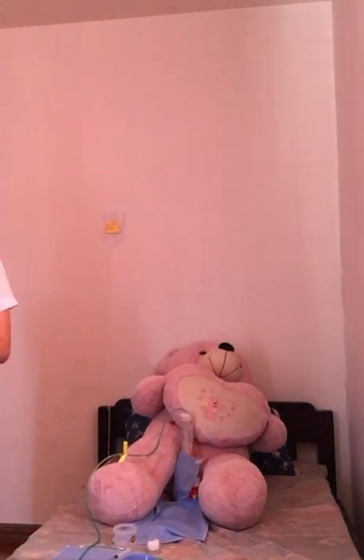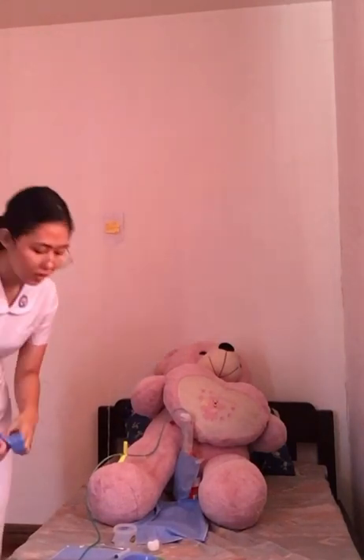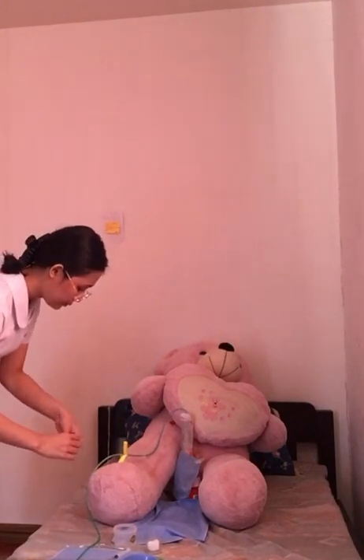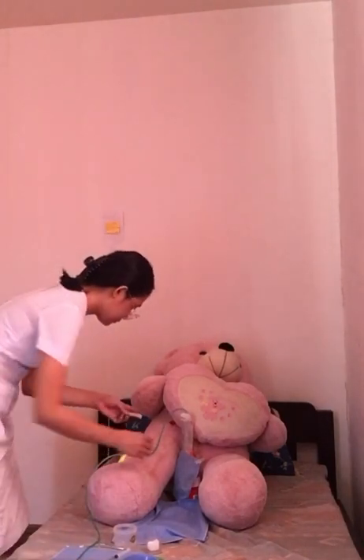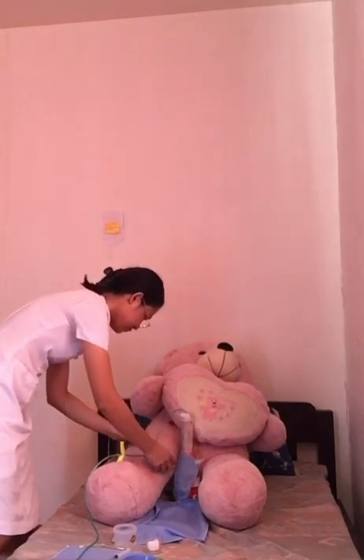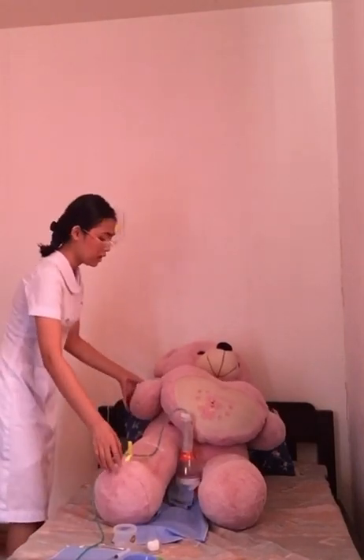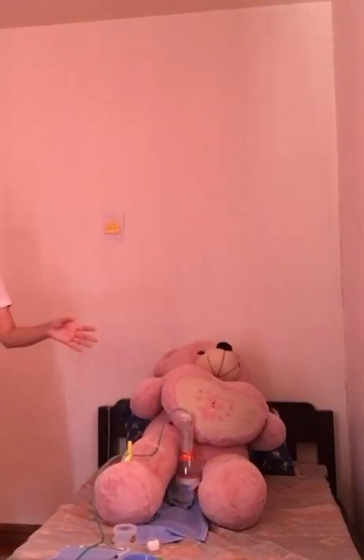And secure the catheter tubing to the inner thigh and lower abdomen by anchoring the device or the tape. We leave some slack for our patient so they can still move freely. And then next, we will assist the patient to a comfortable position, and then we need to drape our client to still provide privacy.